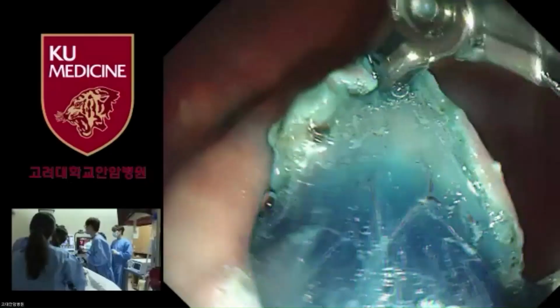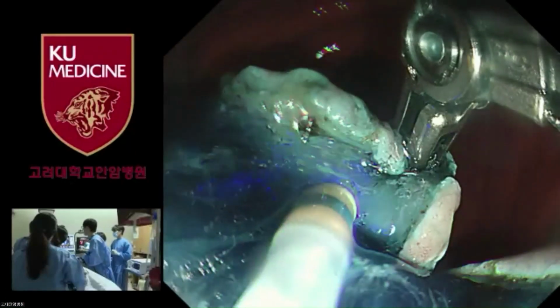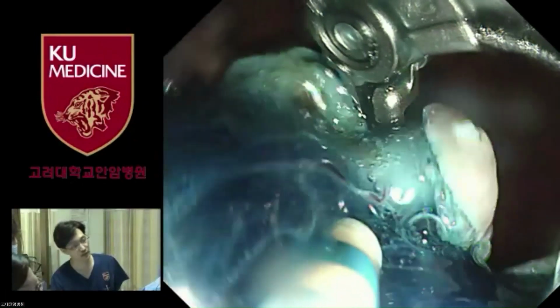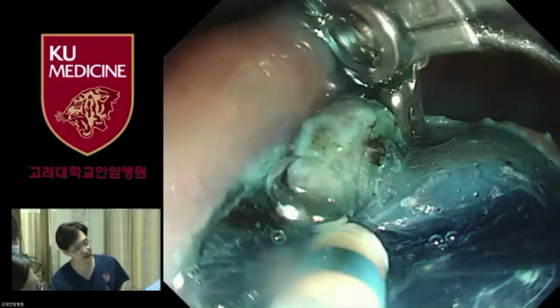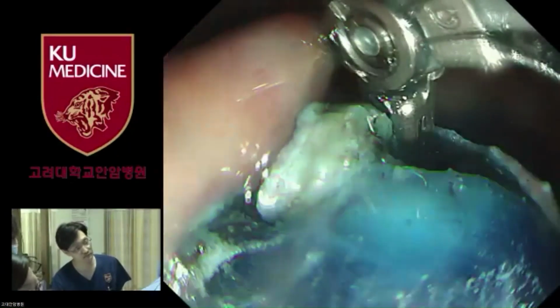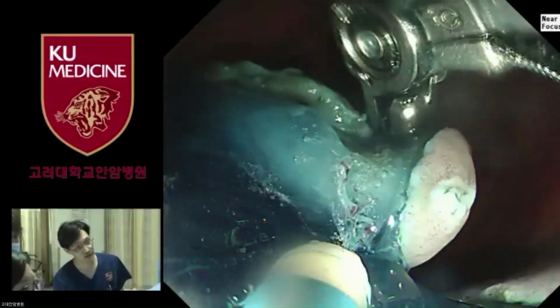Professor Keum, which is the best location or best characteristics of the lesion for using the robotic ESD device? I think we need more clinical cases, but until now we did body side, greater curvature and lesser curvature side, and angle, and all the sides are quite good to be applied with the robotic ESD device.